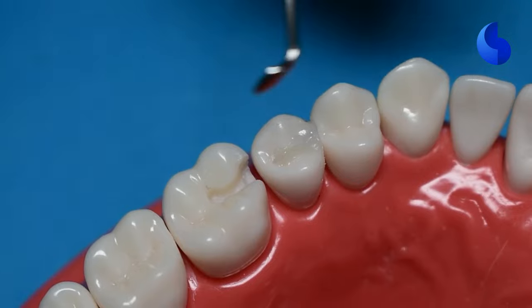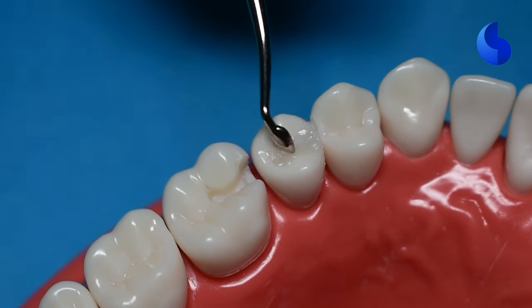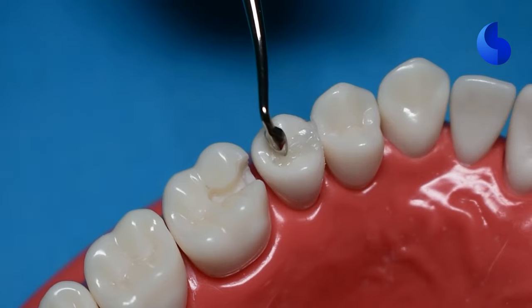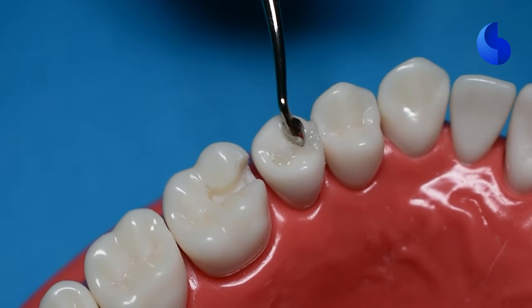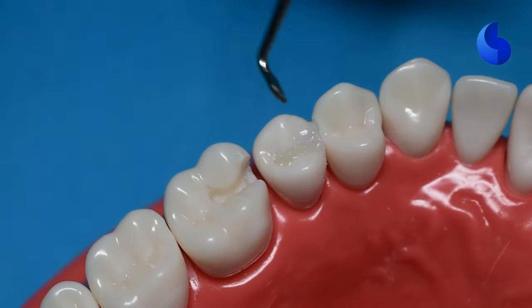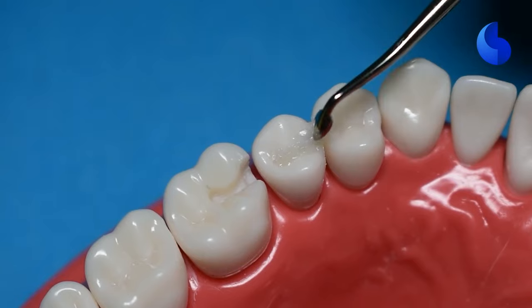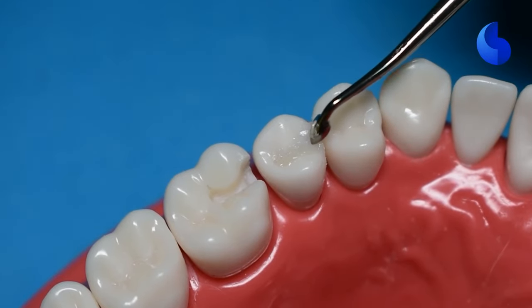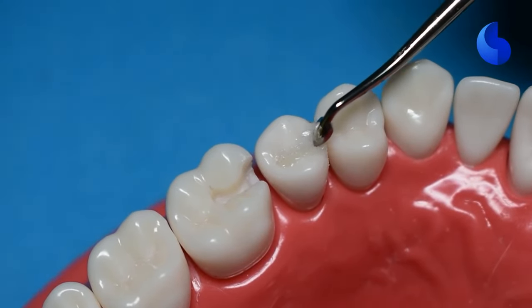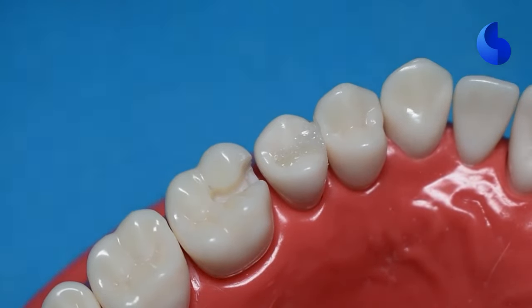At this stage, you can either use an instrument like a cleoid discoid carver and start making those initial grooves, designing your triangular fossa and removing that excess material that's kind of flowed over to your buccal or lingual surfaces.